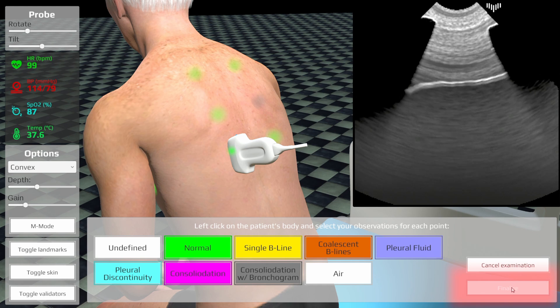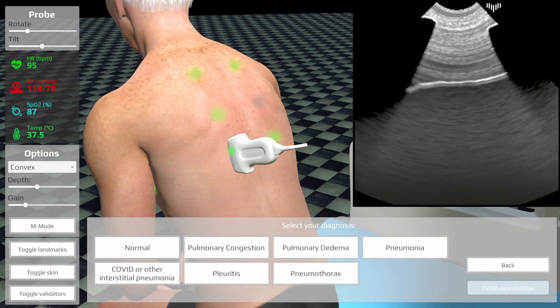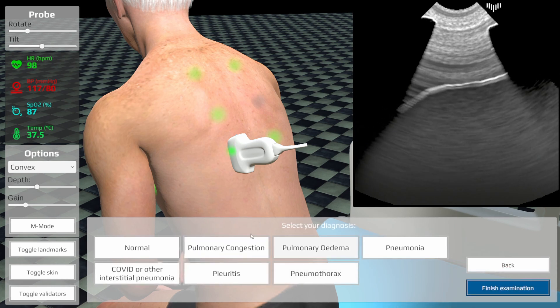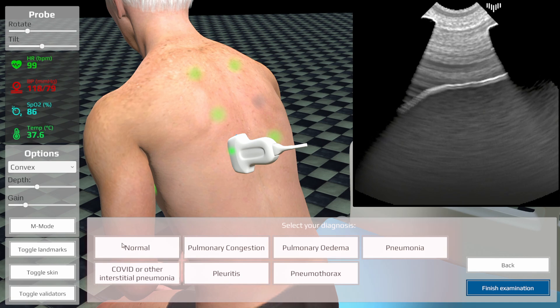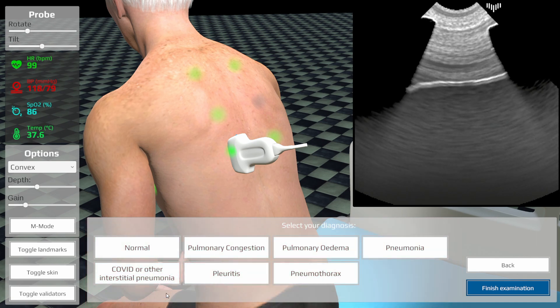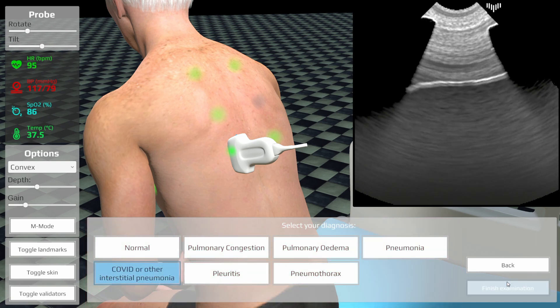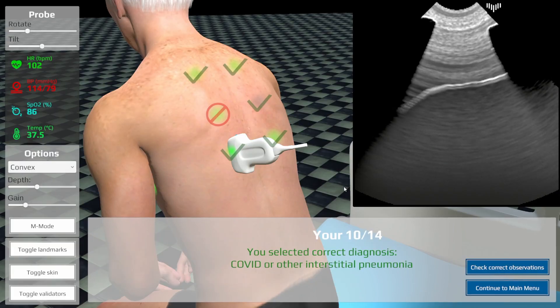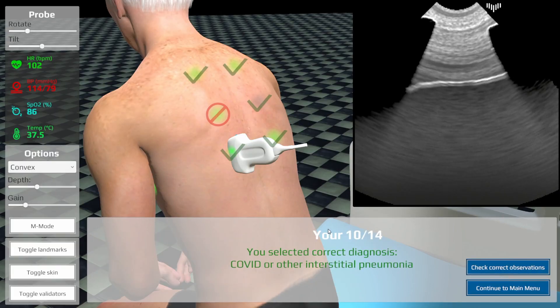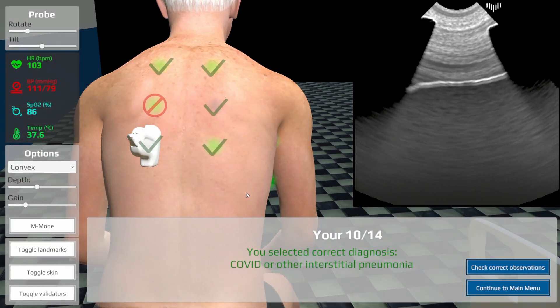After selecting all the answers, finish the exam. You will be asked to propose your final interpretation. It is then verified, and in case of any mistakes, you can learn what went wrong.